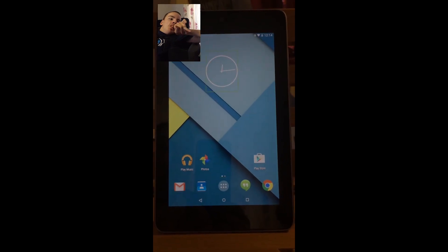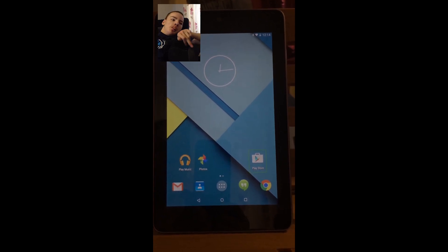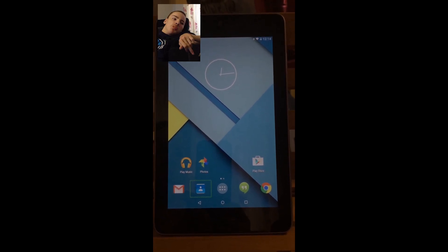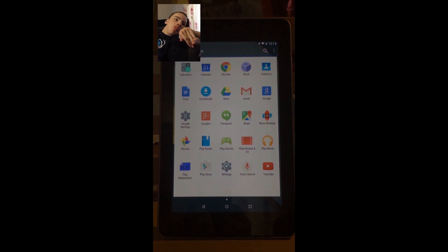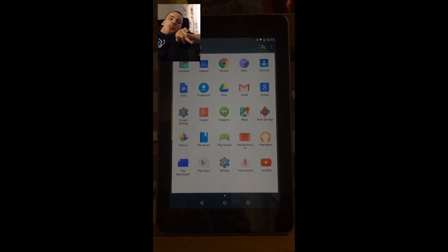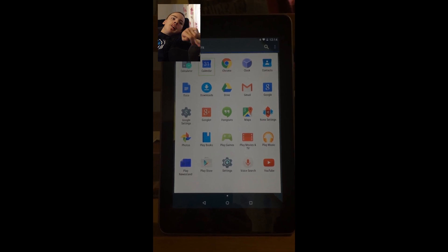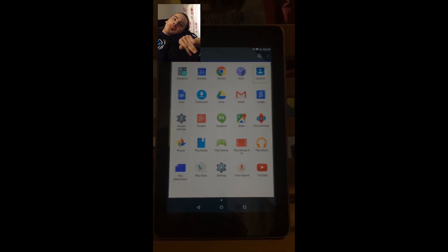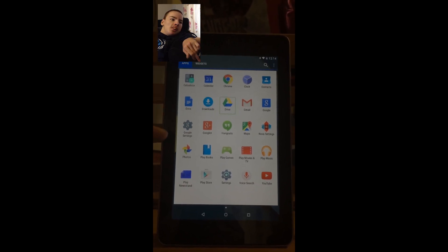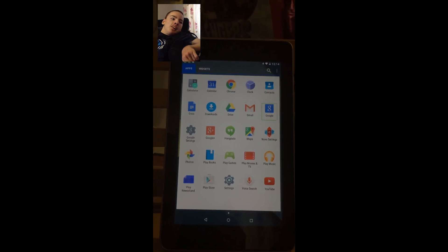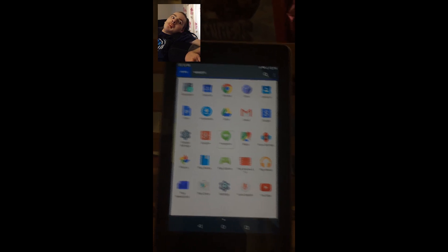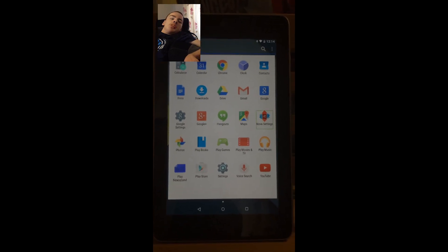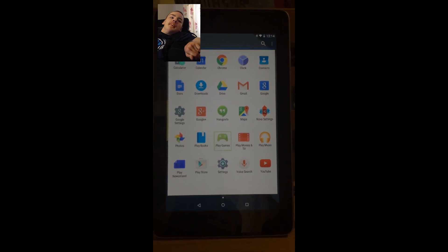Well, should we go, should we open up some more apps? Now this is a downside we've found, isn't it Colin, that it's going to scan every single item. What it could really do with doing is scanning a row at a time, and then once Colin chooses the row it should then scan the items in that row, which would make it a lot faster we think, don't we Colin?